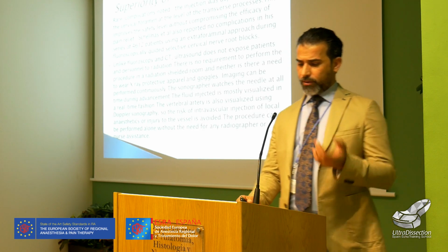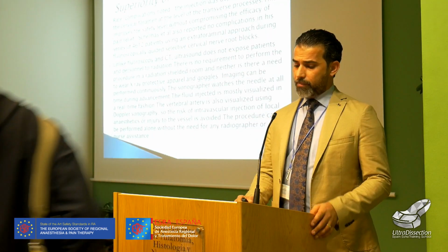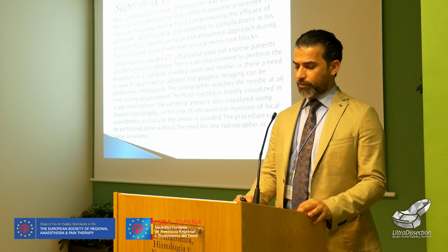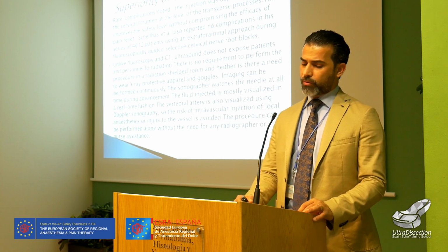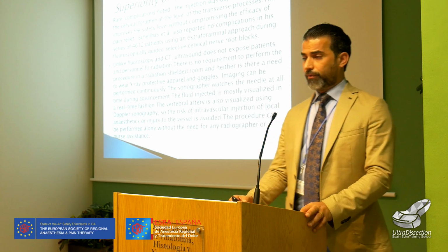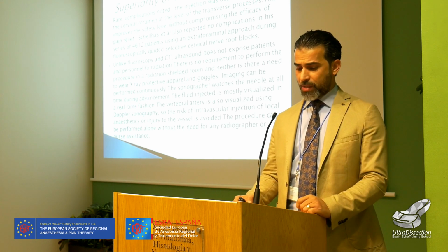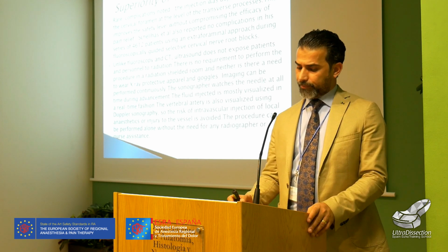Here, we just want to talk about the superiority of ultrasound guidance. In my practice, we have done more than 1,000 cervical interventions with steroid and radiofrequency. Rare complications were noted because the injection is deposited at the lateral part of the cervical foramina at the level of the transverse process. It is not a transforaminal injection. It is lateral to the foramina, so this is called extraforaminal cervical root injection. This improves the safety level without compromising the efficacy of pain relief.